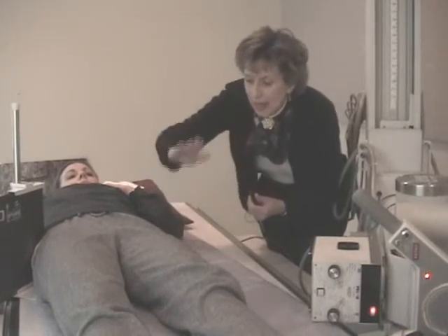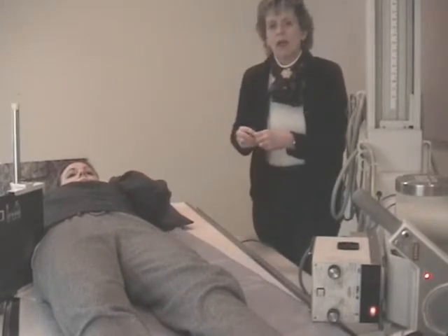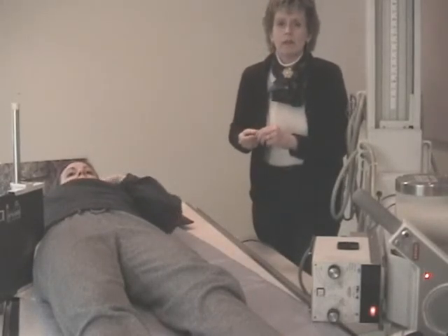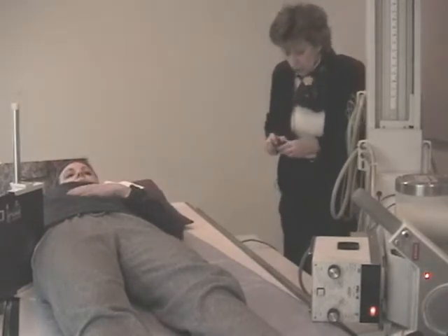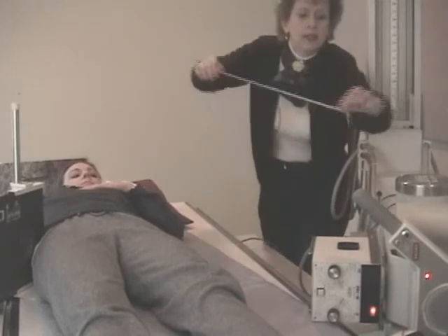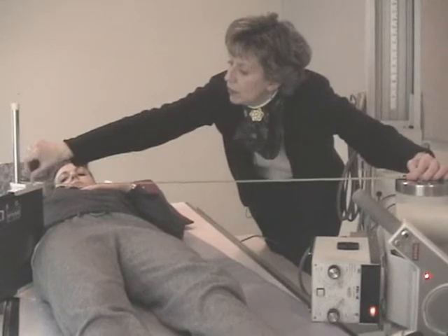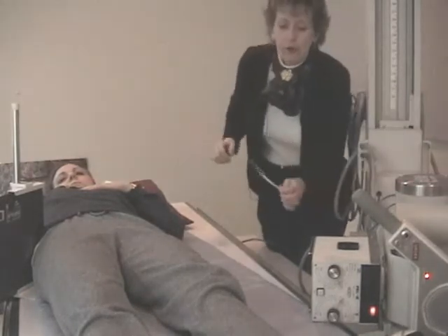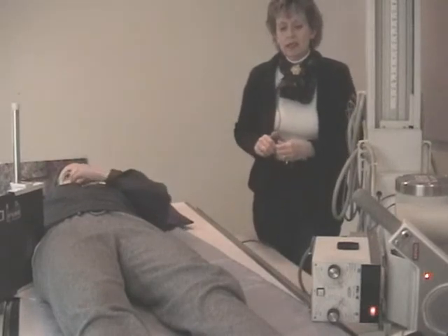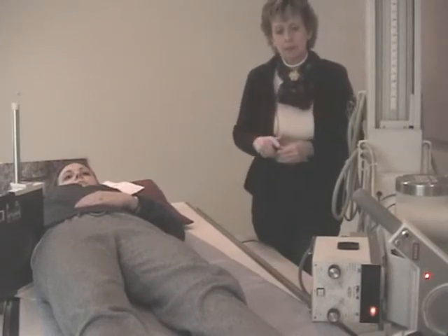That will put you exactly to the center of the grid this way, because the film is the 10 by 12, but the cassette makes it 11 by 13, and half of 11 is 5.5. You want to check your SID, and you're going to go about 1/3 of the way into the tube housing, and you measure. And this setup, I actually got 40. Many times you cannot get 40. Sometimes you're stuck with having like 44 inches, so you'd have to do your density maintenance formula to compensate for that increase of SID. Okay.